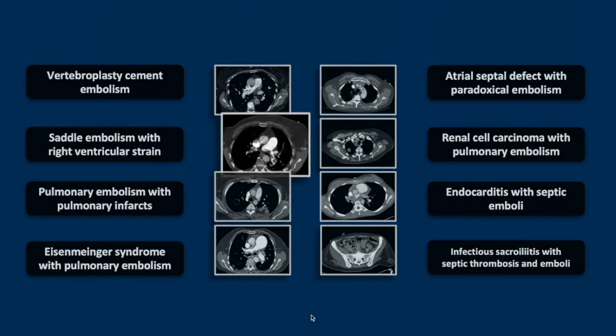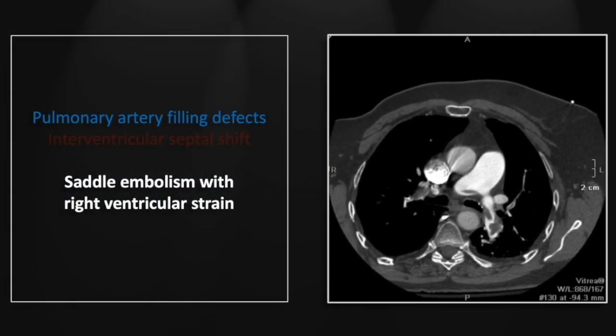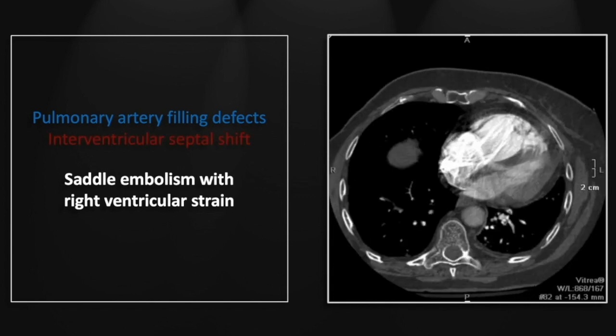Our next case is again relatively straightforward: a saddle embolism with right ventricular strain. There are extensive filling defects throughout the pulmonary arteries, bridging the pulmonary bifurcation and extending down into the lower lobes. There is also straightening of the interventricular septum with associated enlargement of the right ventricle and compression of the left ventricle.